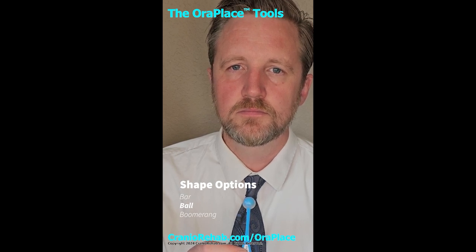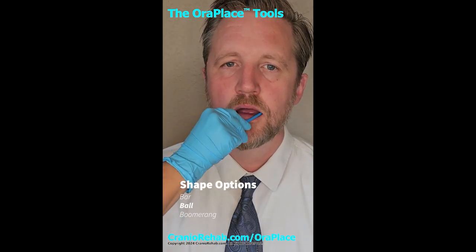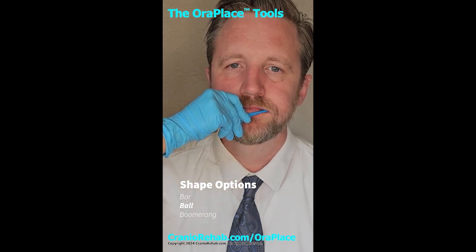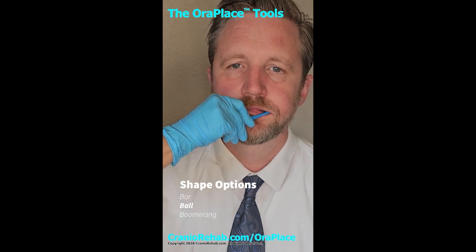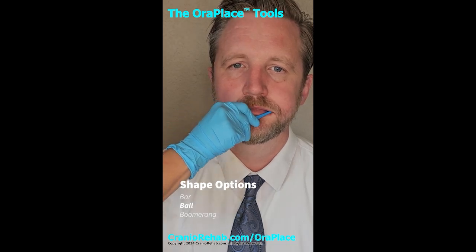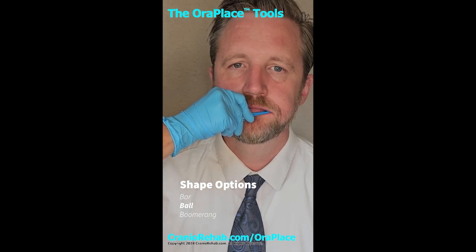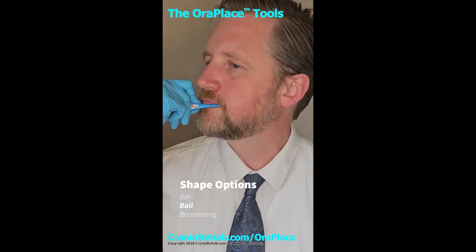So let me show you on Rob. Open up, and now close. You can see that I can control the pressure depending on how much stretch I want. Now to stretch the modiolus, you can place it right here. You can move it back a little too, but generally we want it right at that modiolus point. It's more effective if the patient can keep their lips closed. So go ahead and turn to the right so we can all take a look at that stretch.